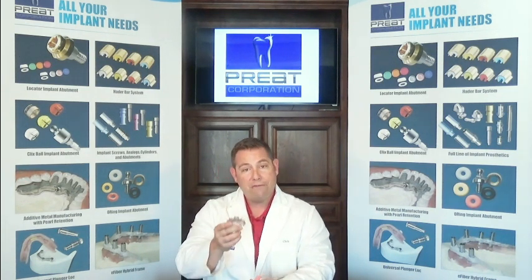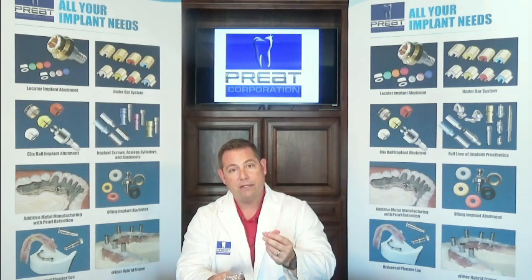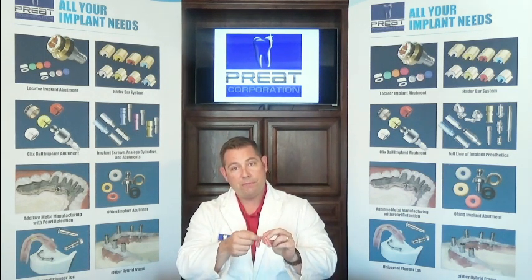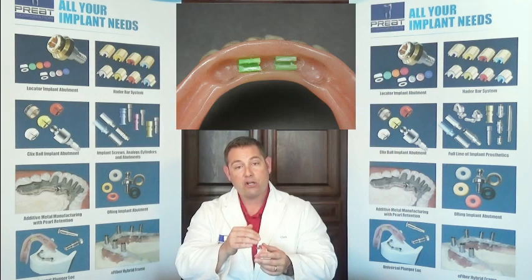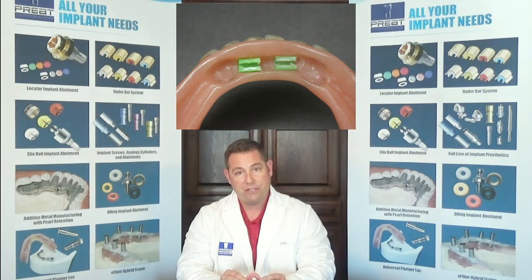So we have our master cast and our prosthesis that we need to reline. Before we process the reline, I recommend removing the old clips from the housings, taking the green processing clips, cutting them down to the height of the bar, and simply sticking the green clips into the housings. This will protect the area around the clips, keep process acrylic out of that area, and maintain the function and fit of the prosthesis.